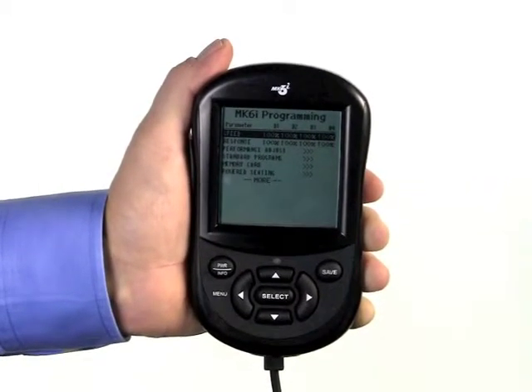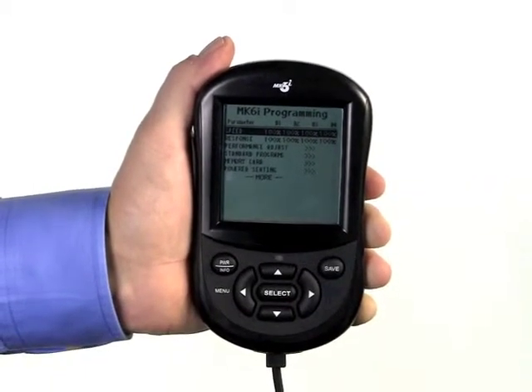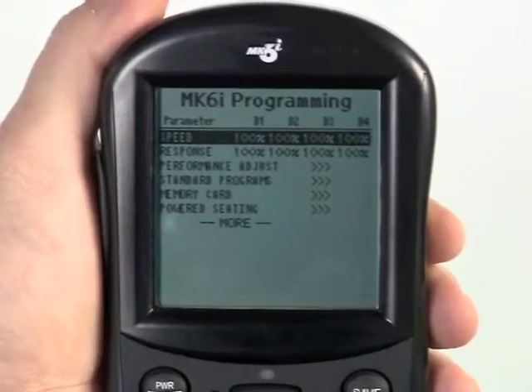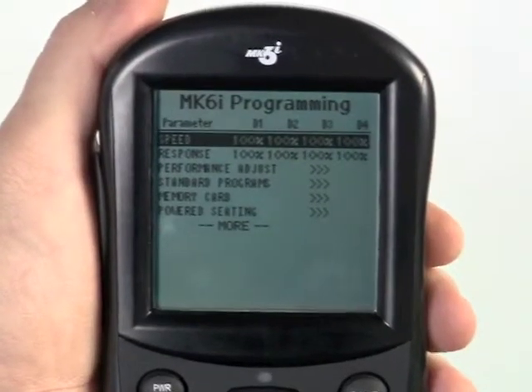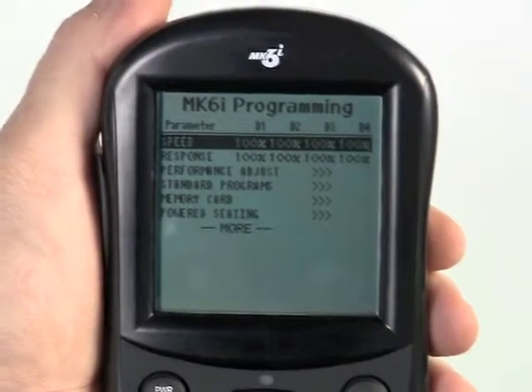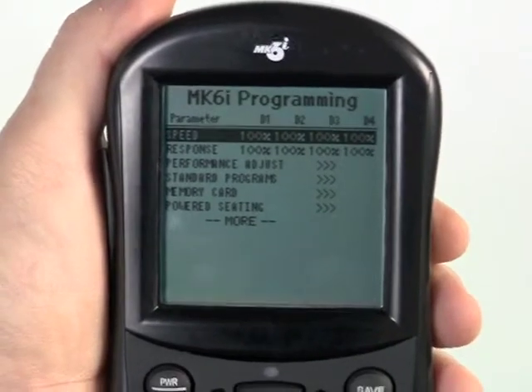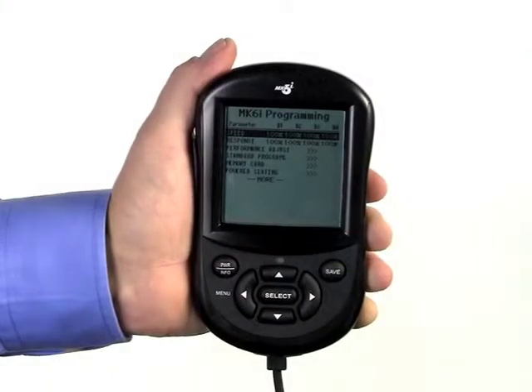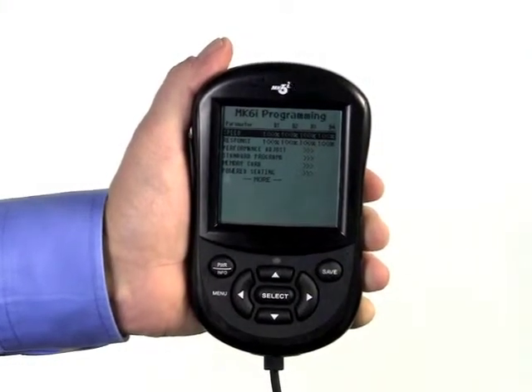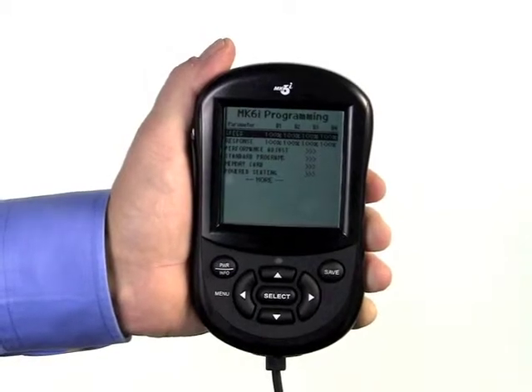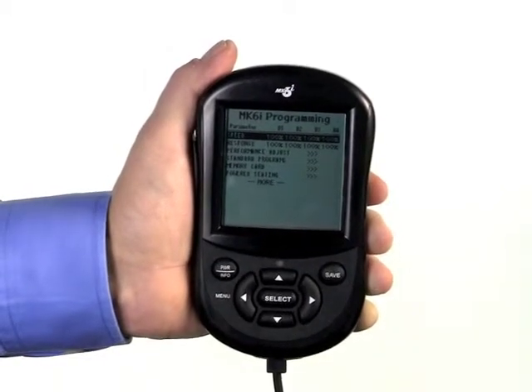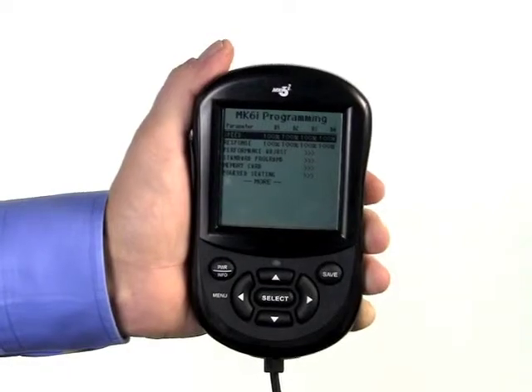When using the driver control to operate other functions besides driving the chair, such as operating powered seating, moving a computer cursor or a mouse, or even using the driver control to change driving profiles one through four, it is necessary to make those programming adjustments as well. Invacare recommends that only qualified and trained personnel perform these adjustments.